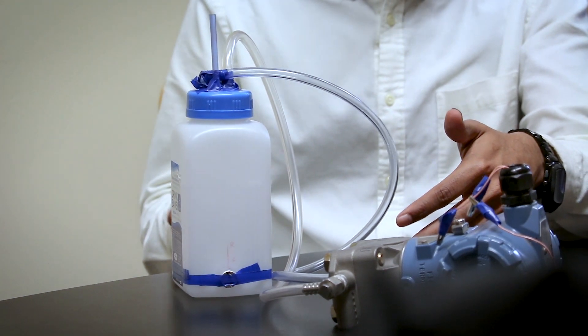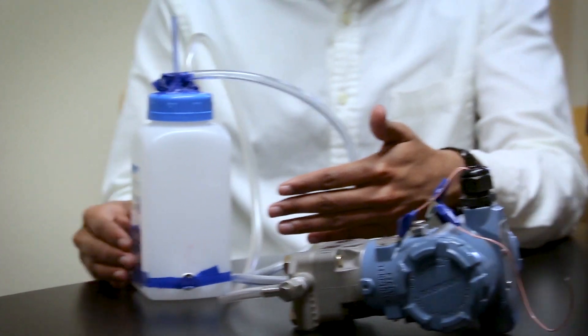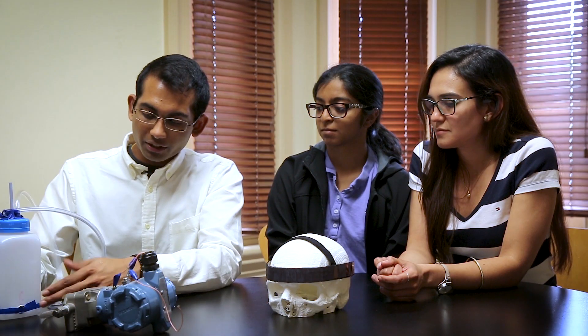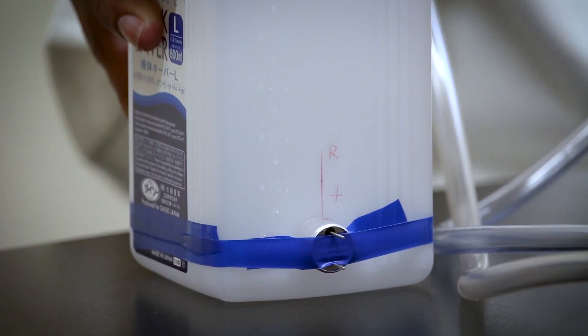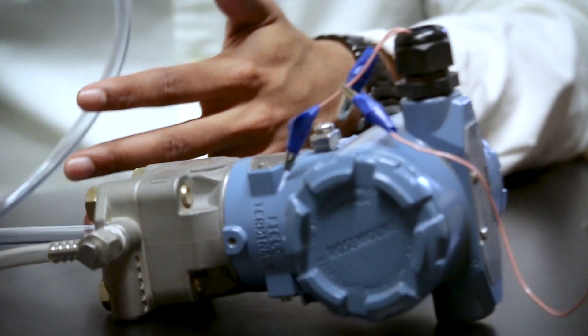What we're trying to do with this setup is measure the pressure inside this bottle as we fill it with water — so the more water there is, the higher the pressure should be. Down here are a couple of sensors, and that's how we aim to use our concept. It's completely non-invasive; it's not penetrating the bottle in any way.